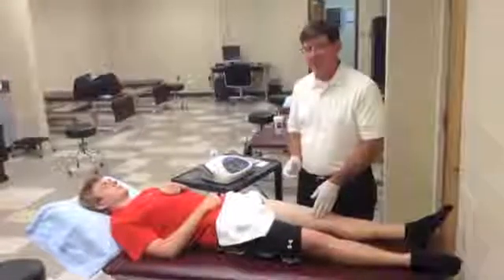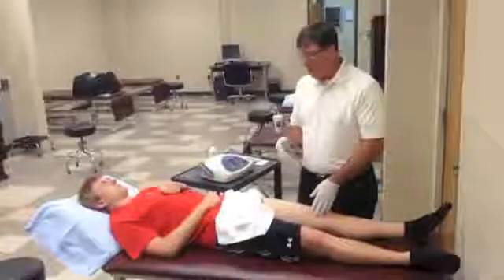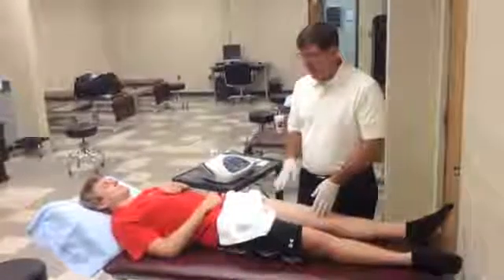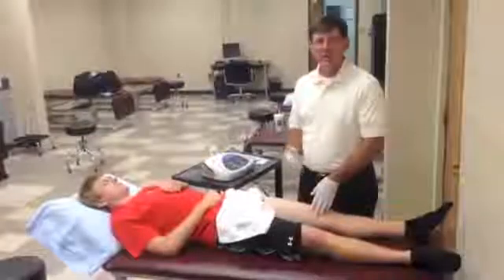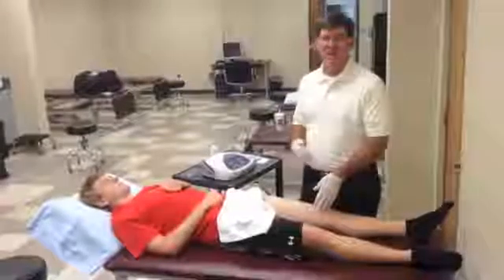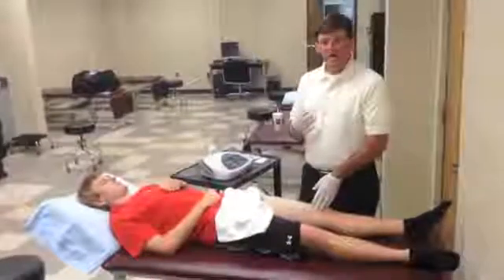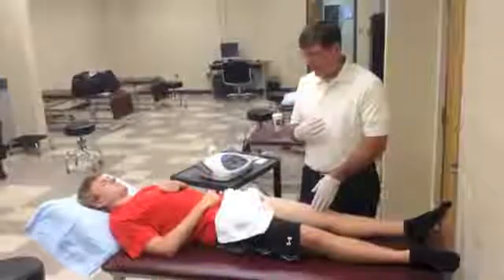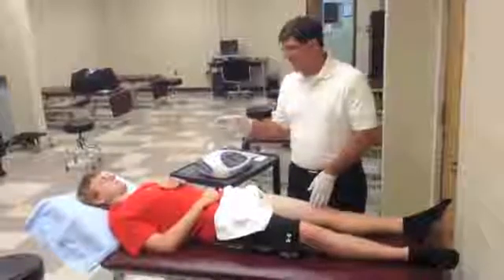But this electrical stimulation is a little different. We're actually not transmitting electrical stimulation to the patient as much as we're establishing a circuit in me, the clinician, as well as in the patient.